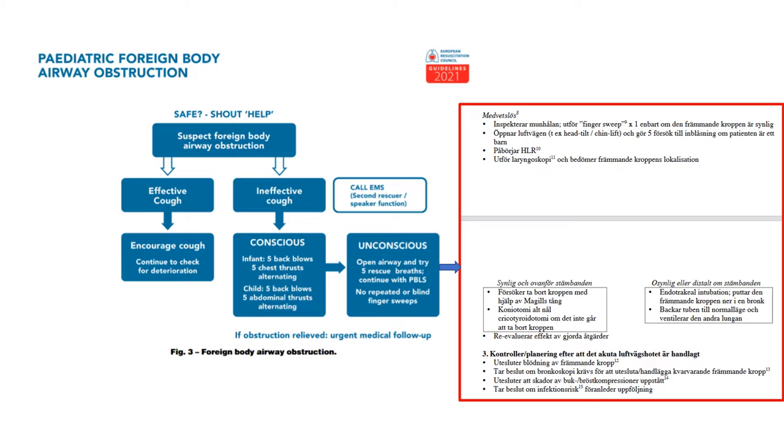And I believe that the Difficult Airway Society is against jet ventilation, which I'll show you soon enough. Just so you know, this area is really controversial. It's a horrible situation, but it's nice to have some tools in your toolbox. If I ever stand in this situation, I'll try to grab the laryngoscope and get the thing up with Magill's. And if I can't see anything, I'll try to intubate. Okay.